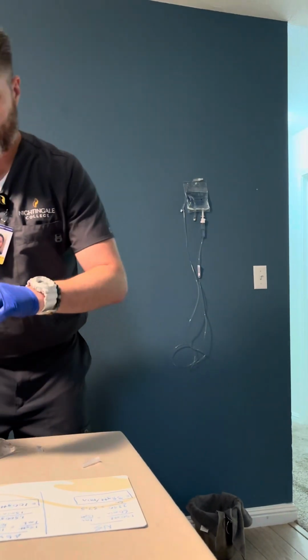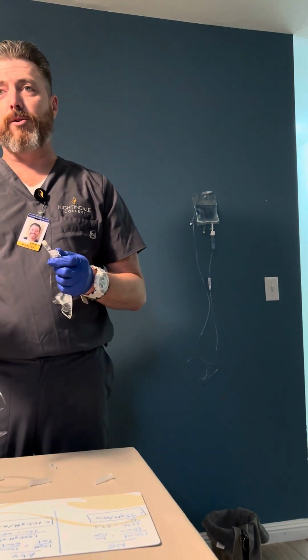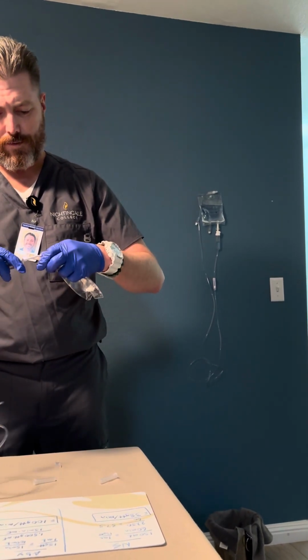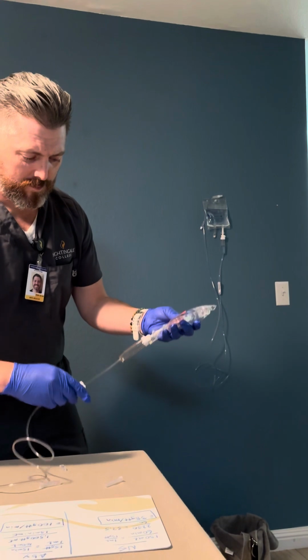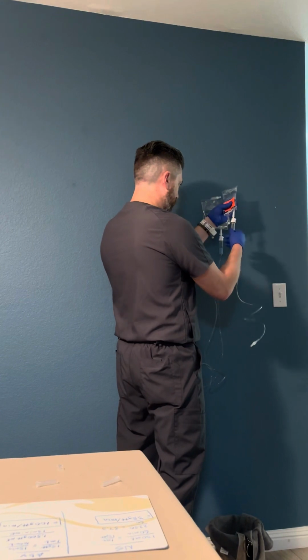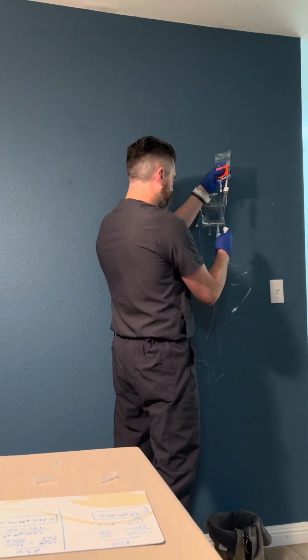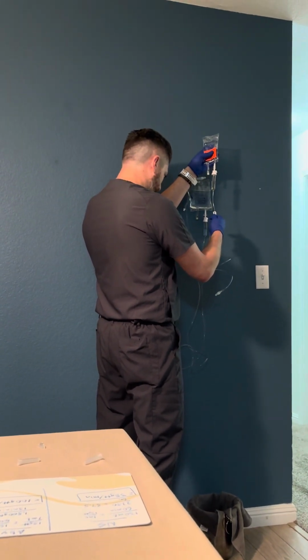So it'll be the same thing for this. I'll remove the spike end. We want to make sure, check again, we've gone through our patient rights. We want to make sure our patient doesn't have any allergies. Insert the spike end all the way. Want to open up a little bit, just fill up the tube halfway, and then we'll start opening the roller clamp just to clear the air out of the line.